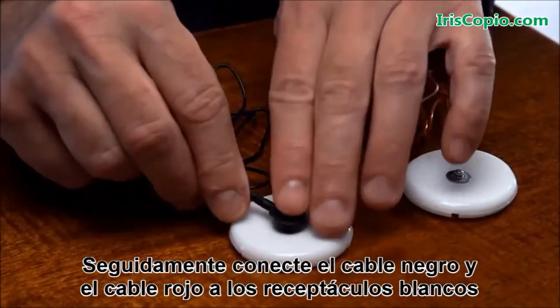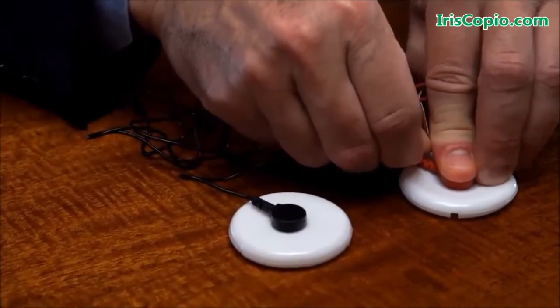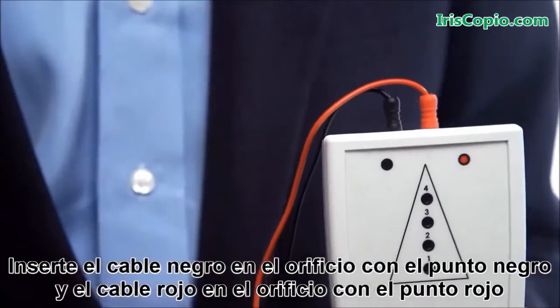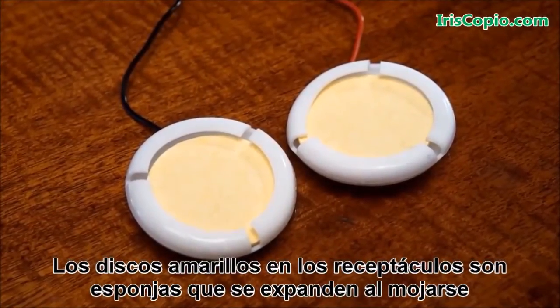Next, open the headset packet and connect the black and red wires to the two white caps. Insert the black wire into the hole with a black dot and the red wire into the hole with a red dot.